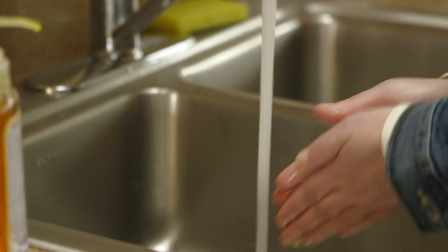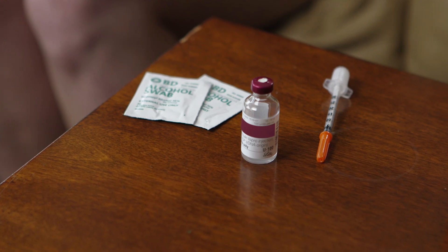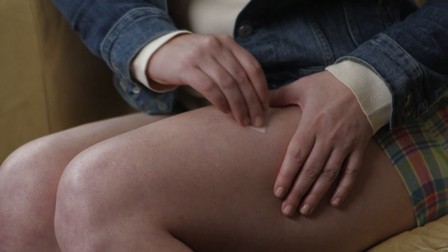Before you begin, wash your hands thoroughly. Next, set up your supplies in a clean, well-lit, flat area such as a table. Now, clean the skin using an alcohol pad.